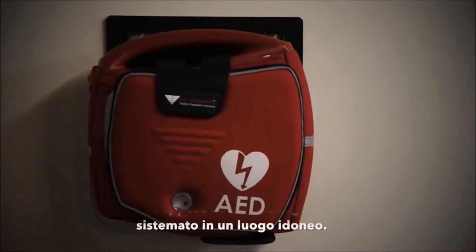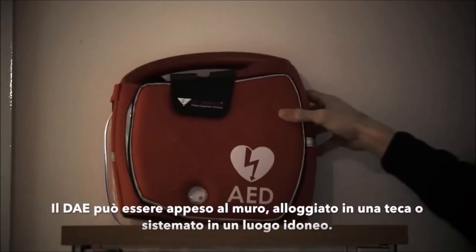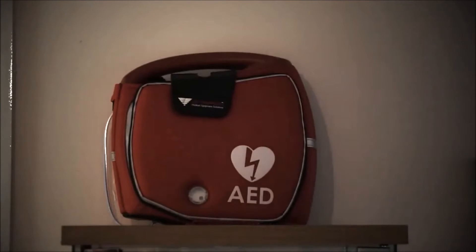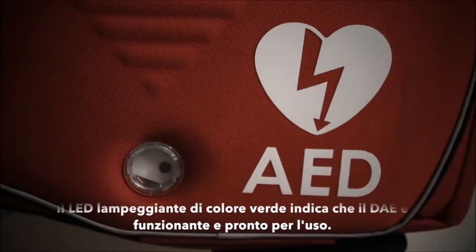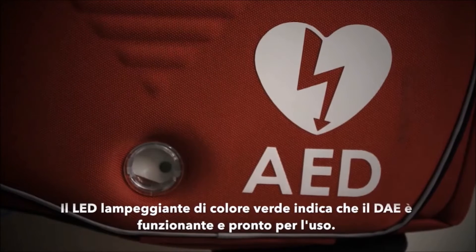The defibrillator can be mounted on the wall, kept in a purpose-built cabinet, or stored in a convenient location in this bag. A green status light flashing on the front of the machine indicates that the Rescue Sam is in standby mode and ready to be used.